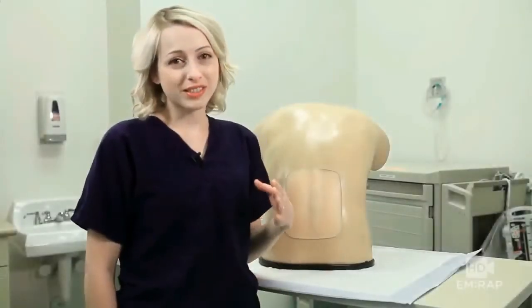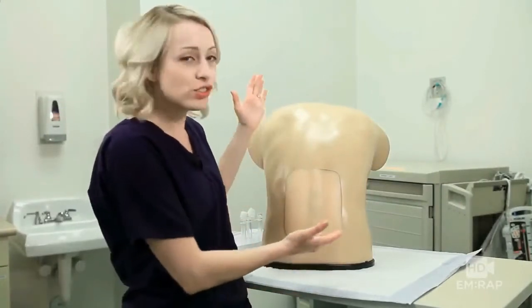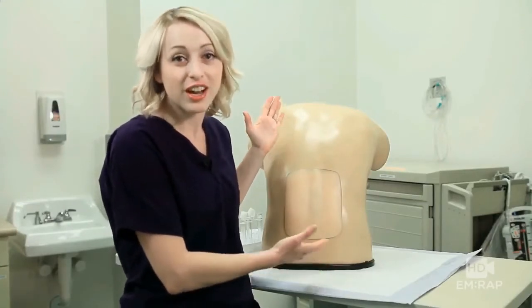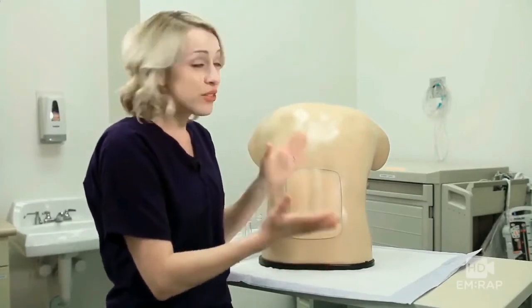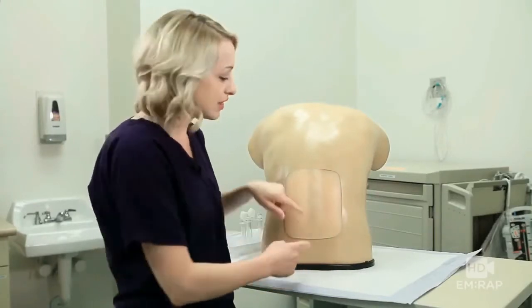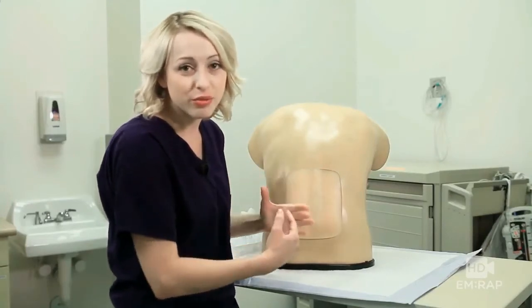I'm Dr. Jess Mason and we're going to show you how to do a lumbar puncture. You want to position your patient either in lateral recumbent or, as shown here, sitting upright. This patient prefers to sit upright. Either way, you want to have them arch their back and flex at the hip — that's going to increase the distance between the spinous processes so your needle can more easily fit through.